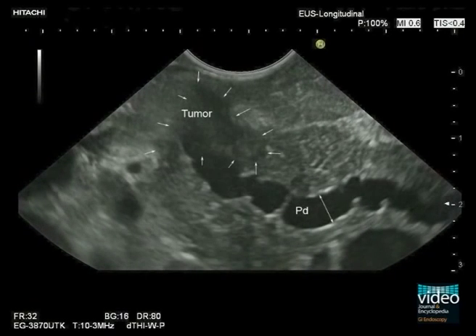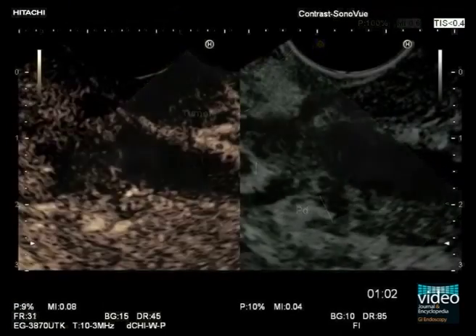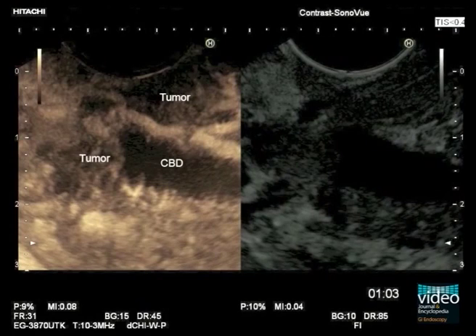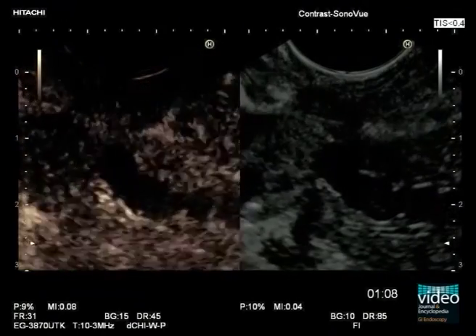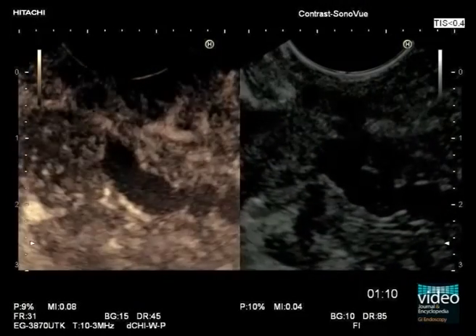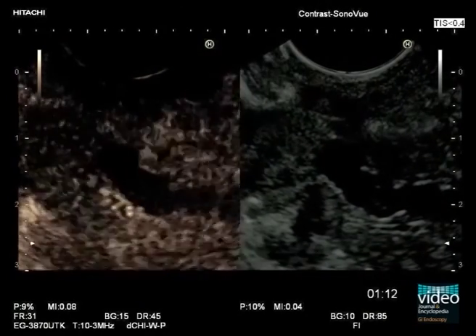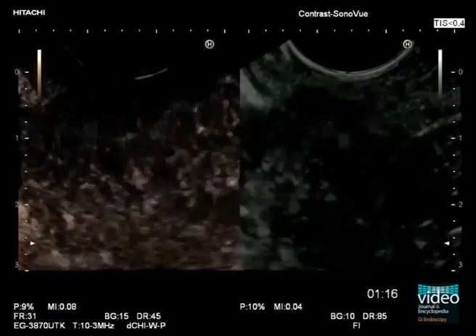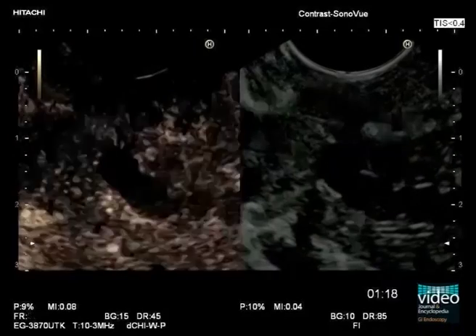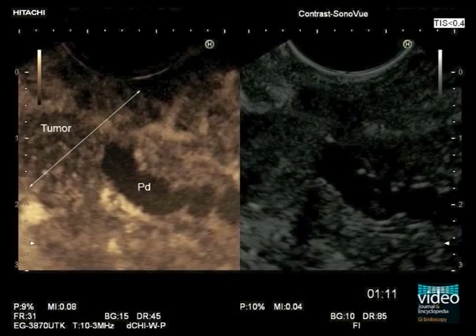However, further findings question this assumption. Marked dilatation of the common bile duct, as well as of the pancreatic duct, is apparently not caused by fibrosis or calcification within the pancreatic head, but by a hypoechoic tumor in the ampullary region. Contrast-enhanced EUS demonstrates hypovascularity of the tumor. Diagnosis is made of an ampullary cancer with obstructive chronic pancreatitis with recurrent acute attacks, and surgical treatment is decided.